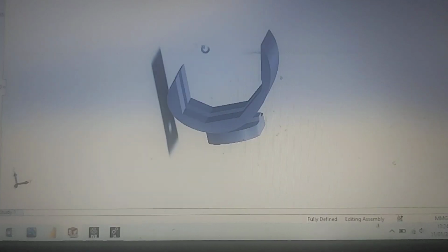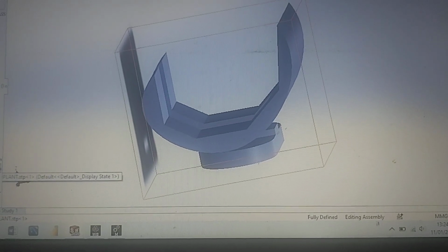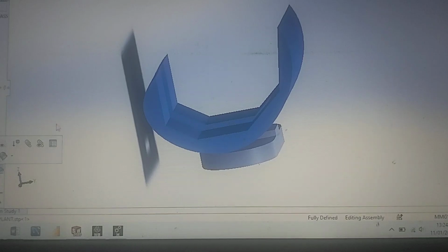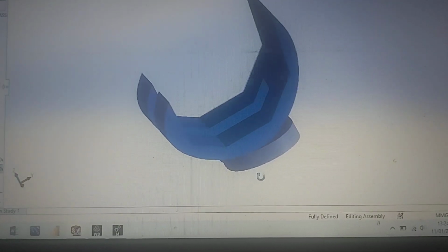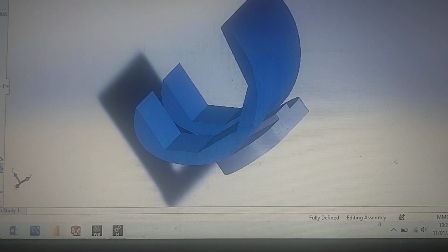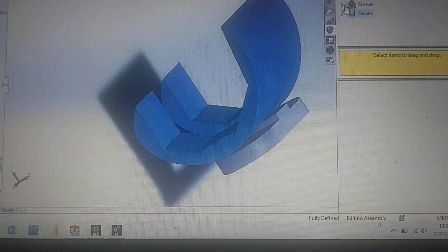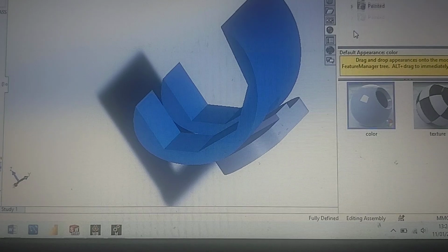It consists of mainly three components, but I have designed two components. The upper one is called the femoral component, as you can see here, and the lower one is called the plastic spacer, and there is also a third component in many cases, which is called the tibial component. But I have designed only two components and simulate and use as is.